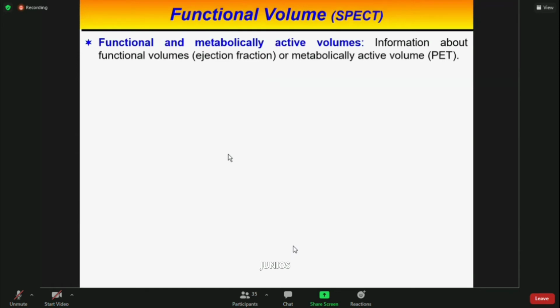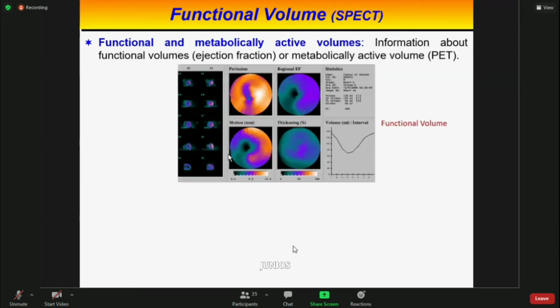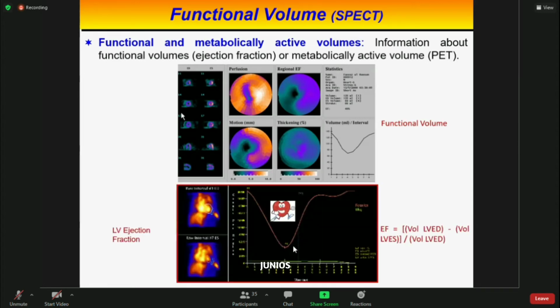Nuclear medicine imaging can give information about the functional volume, such as ejection fraction in cardiac SPECT. Functional volumes, mostly in cardiac imaging, that is end diastolic and systolic volume and stroke volume, are indirectly estimated through activity measurement, assuming the myocardial signal intensity is proportional to the blood volume in the left ventricle cavity. In other words, measuring such volume does not involve actual volume delineation.